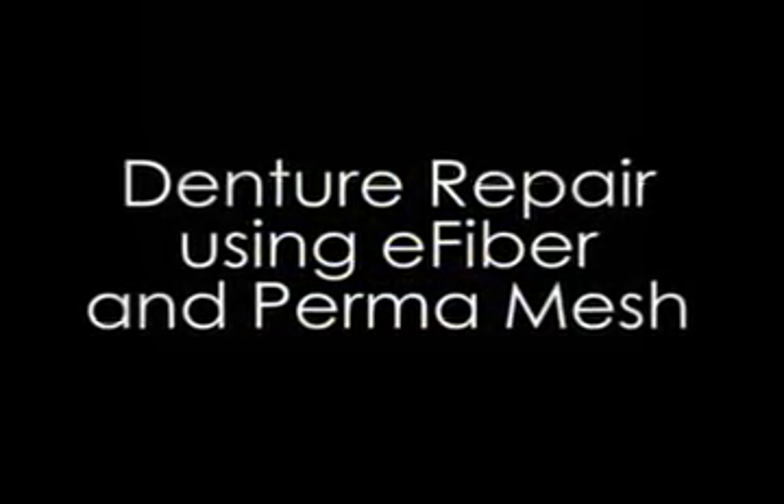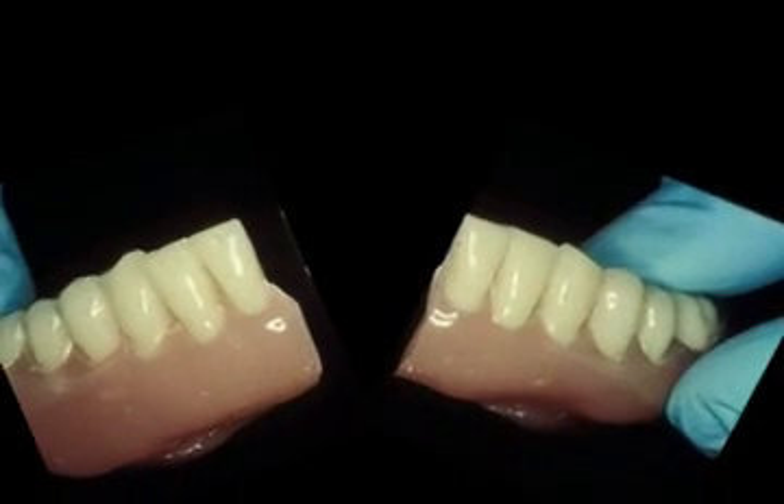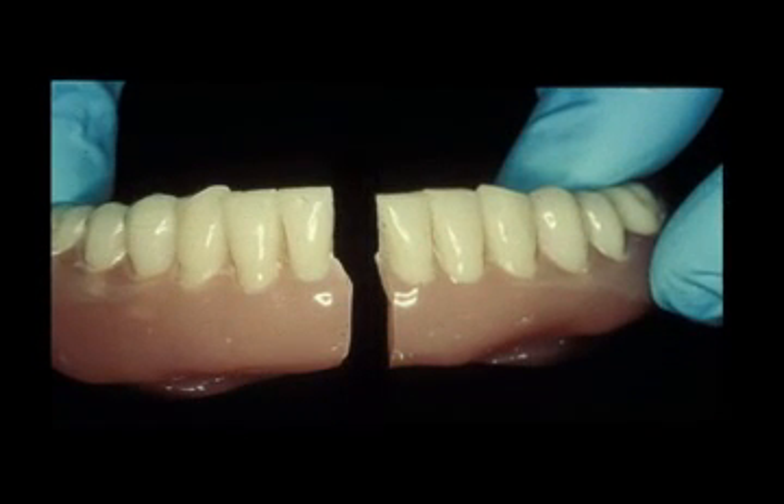Denture repair using E-fiber and Perma Mesh. Most fractures in removable partial and full dentures are predictable in location. Lower full dentures most frequently fracture down the midline between the centrals.